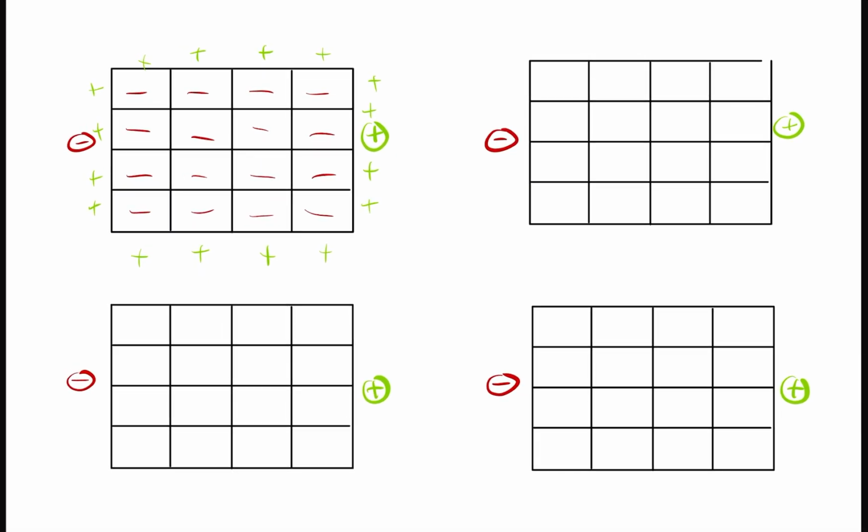Right. So this is where we start. We are measuring the outside of the cells, in relation to these electrodes that we have right here. But now, when everything is the same and nothing is happening, we've got something called the isoelectric line. It's just flat. Nothing is happening. You can see that in the movies, when the person is dying on the operating table, it's flat.